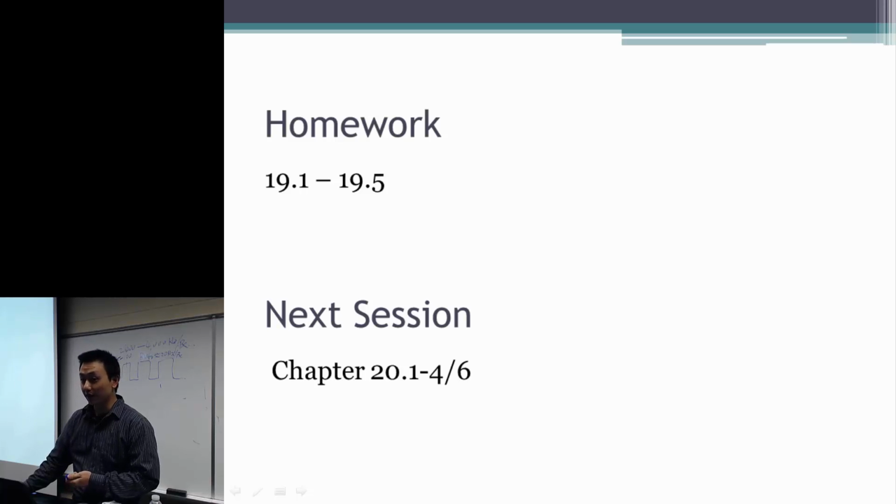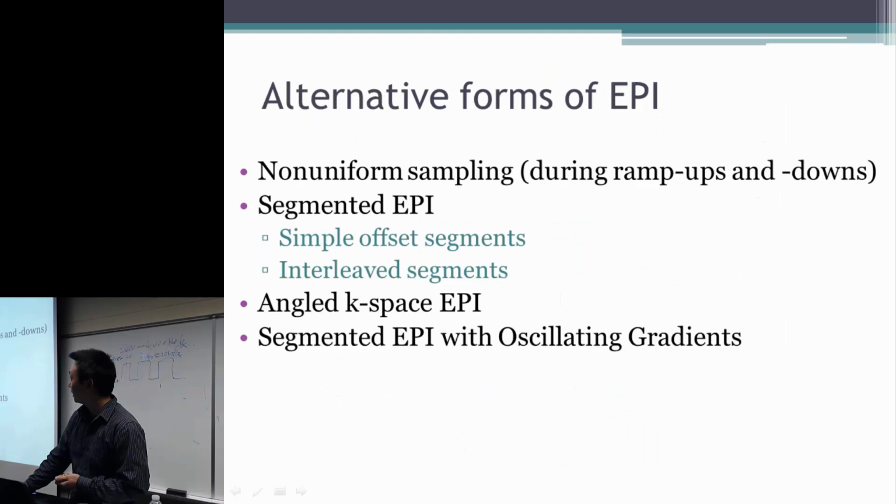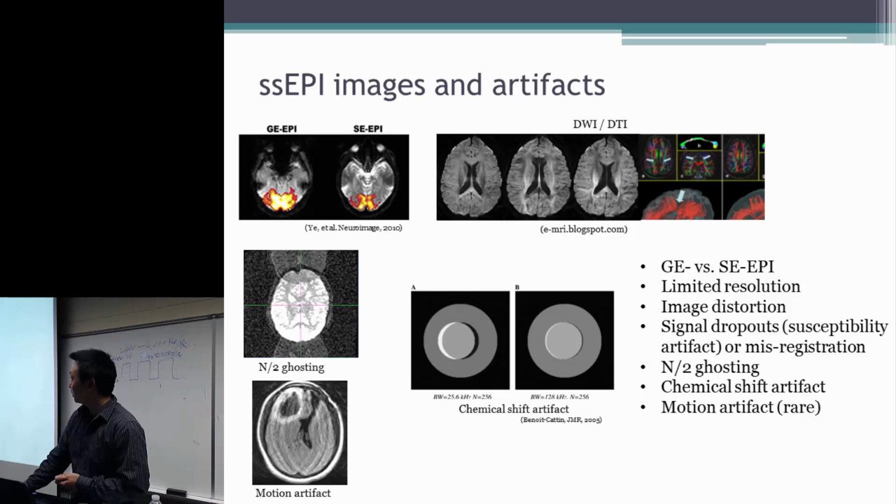For diffusion weighted images, low SNR is usually what you get, because of the use of the diffusion weighting gradient. And if you are doing this at 7T, that means you are actually using very small voxels.